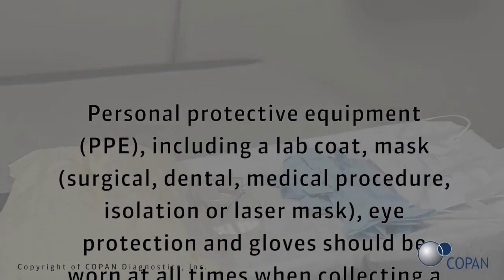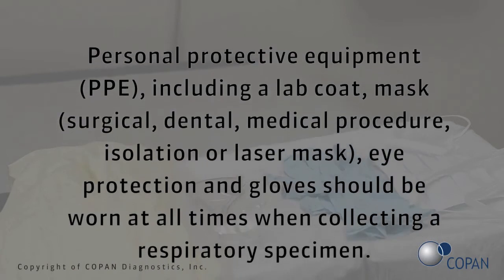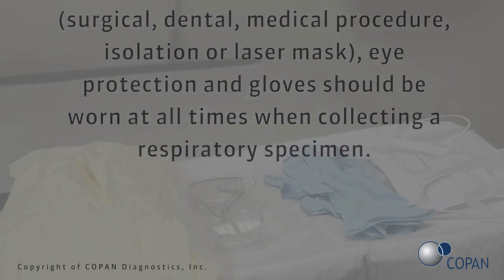Personal protective equipment (PPE), including a lab coat, mask — surgical, dental, medical procedure, isolation, or laser mask — eye protection, and gloves should be worn at all times when collecting a respiratory specimen.